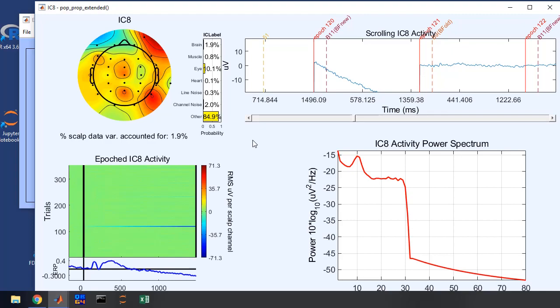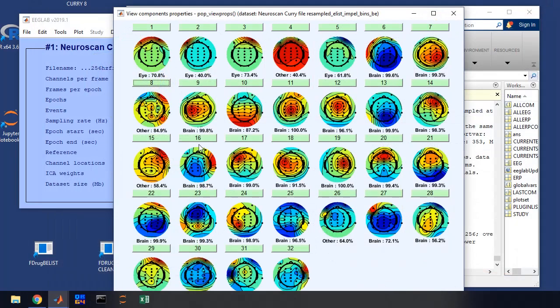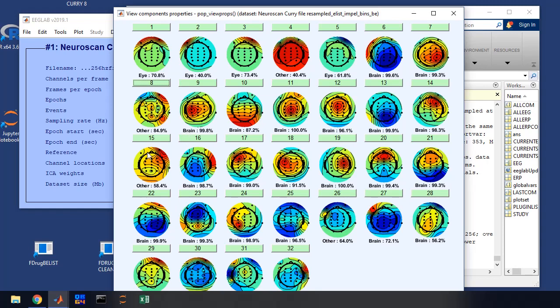So it's not ERP. So we're going to get rid of that. We'll pull that out. So I'm going to write down on my piece of paper, do you have a place to write down which labels you remove, which components you remove when you're processing? And I can go back and look at it if I need to, if there's something at issue with that data, or I want to reprocess it just to make sure that it's accurate. So I processed this one before. The only other one, the only other component I removed was 15.